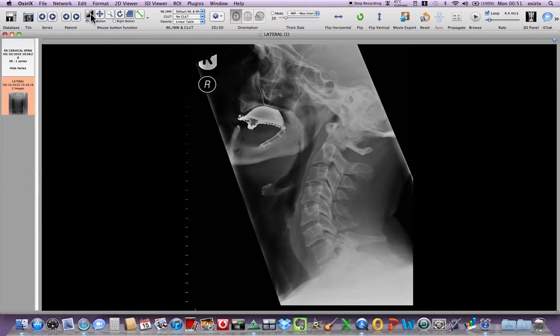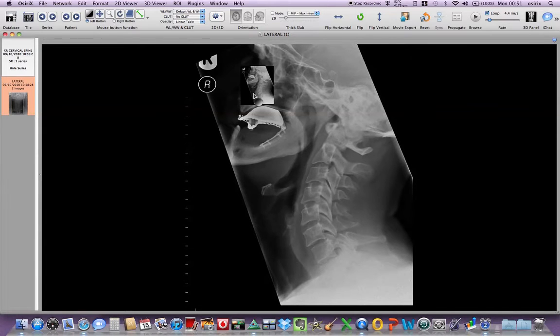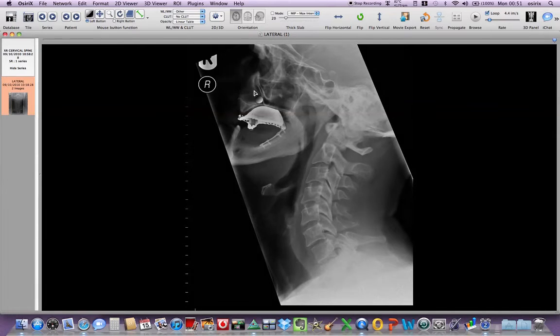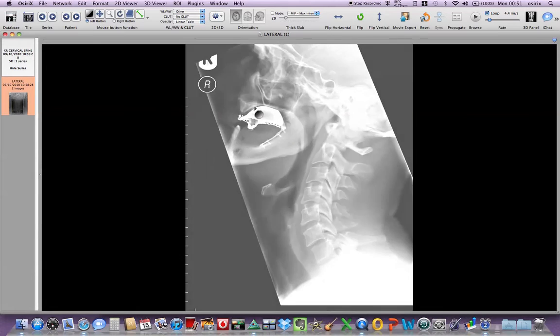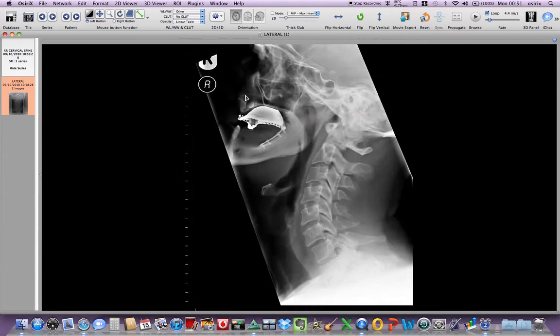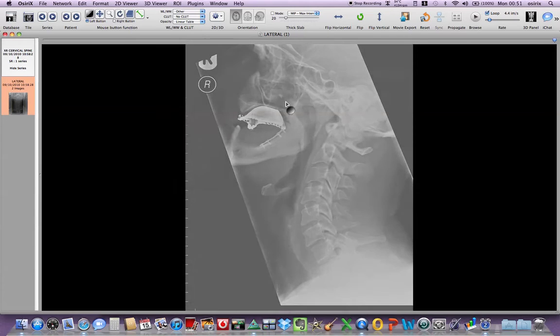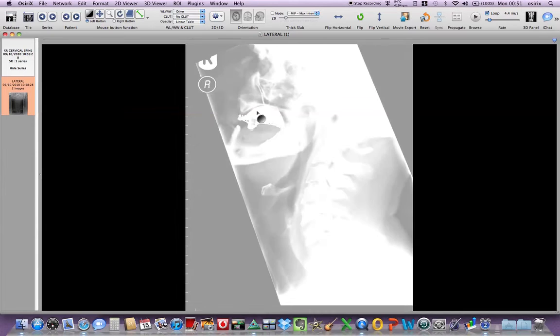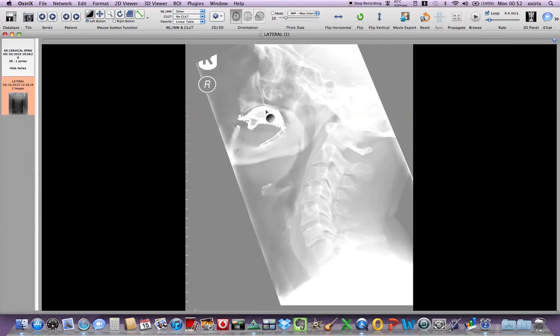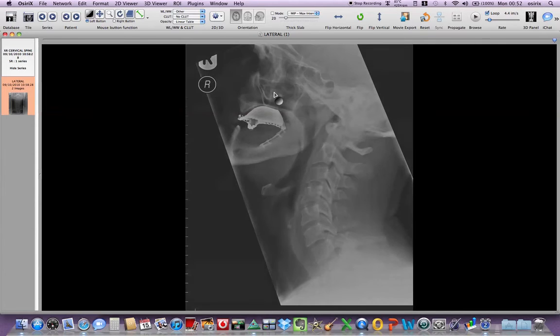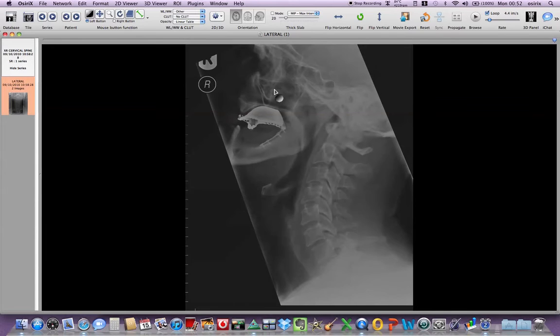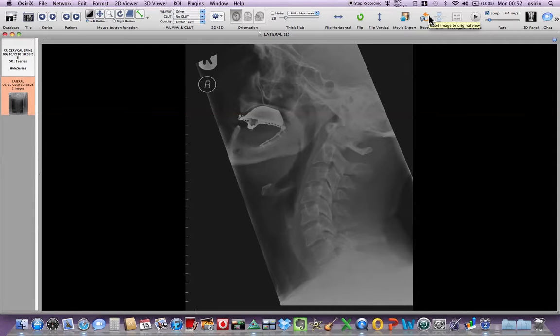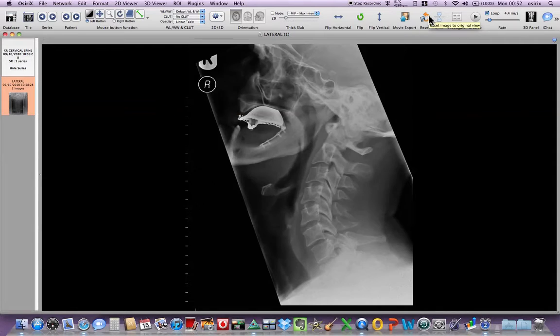So I click it, then I click the left mouse button and then I move the mouse up and down, changing the brightness and contrast. Occasionally you can overdo it with this method and you need to restore the original default settings by pressing the reset button.